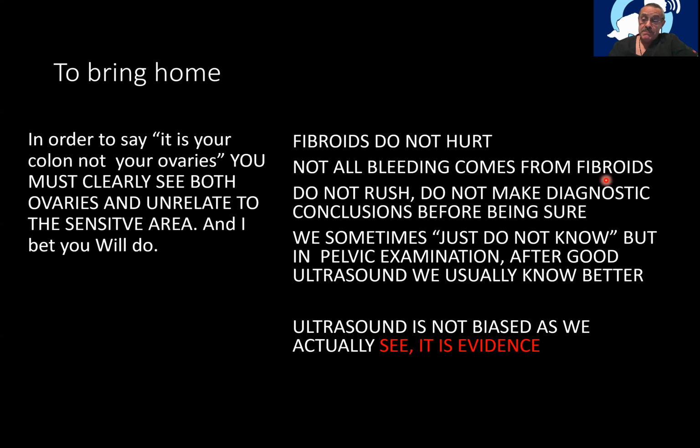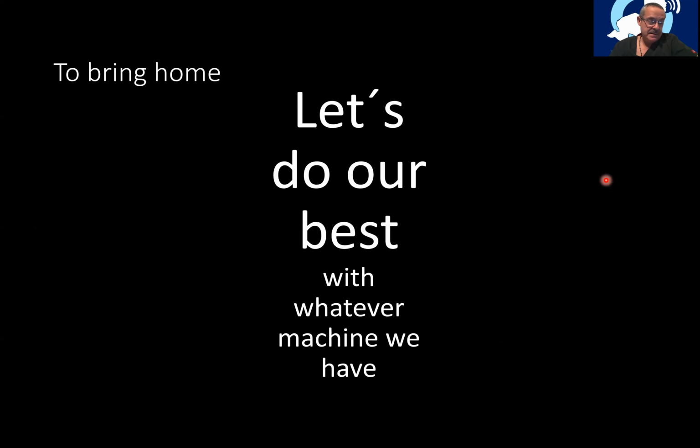But remember, we have to build in ourselves the capacity of saying, I don't know. Sometimes you don't know. But after good ultrasounding, we usually know better because ultrasound is not biased. As we actually see, it's clinical evidence. It's a prolongation of your sight. You're looking at things.